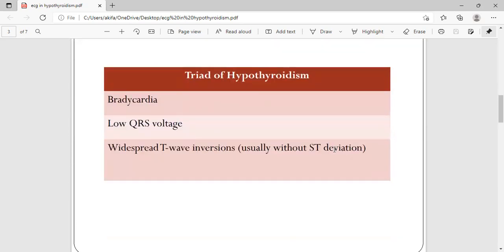The triad of hypothyroidism on ECG consists of: first, bradycardia due to decreased sympathetic system activity; second, low QRS voltage due to gelatinous tissue deposited in the myocardium; and third, widespread T-wave inversions, usually without ST deviation — this has been commonly seen.